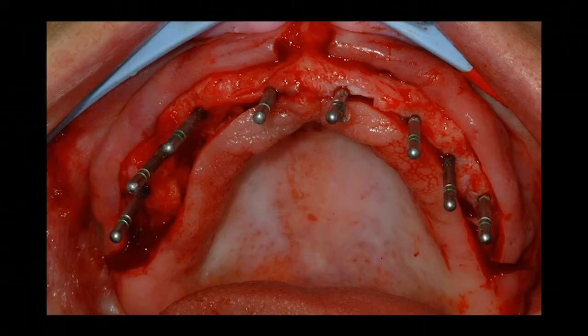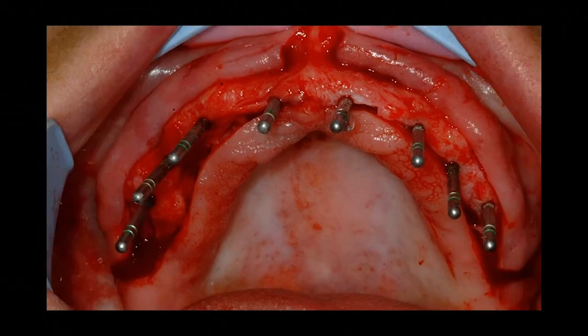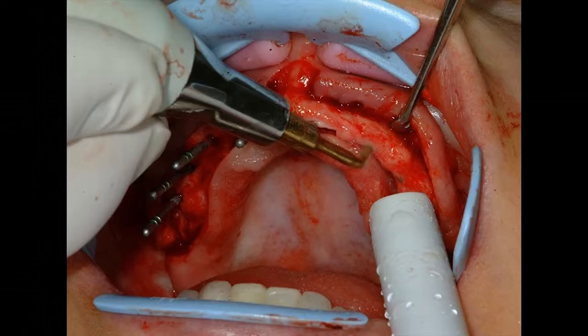So we get this case in. There's no attached tissue down here, no bone down there. This is bad. Everything's just falling apart. So basically we took this out, bone grafted it, added some other implants, and I think we used some of the originals. No, I guess we used these two. We kept those two. But all this had to go.